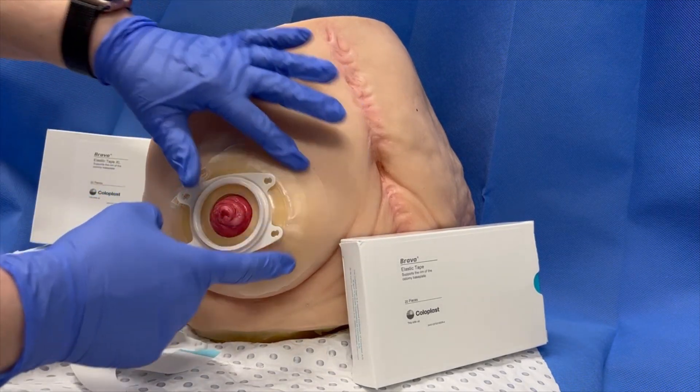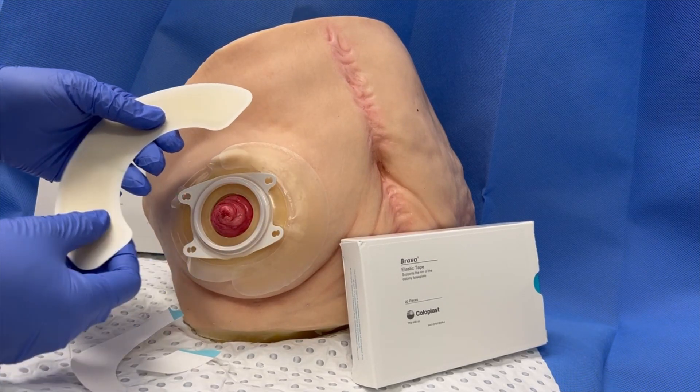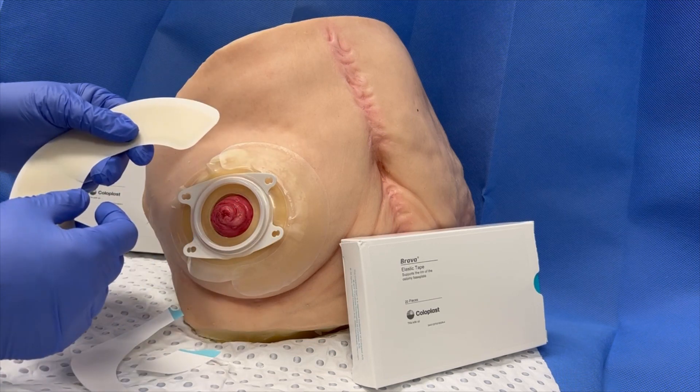That's the standard size. This is the XL, which is a bit wider and offers more material to help bond around the shape of perhaps an enlarged hernia.